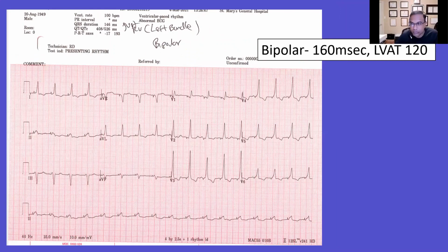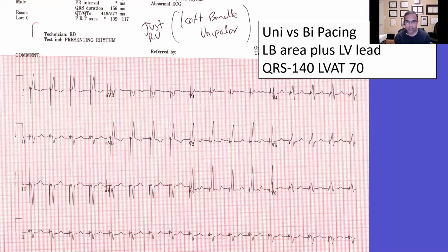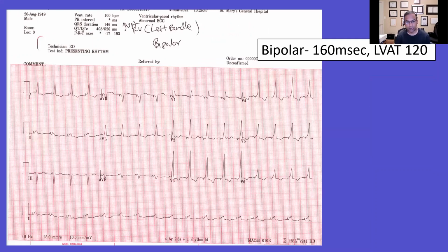Yeah, that's usually what happens. With unipolar, you get this beautiful classic selective left bundle type pattern. And then when you go to bipolar, suddenly you get this almost pre-excitation slur looking thing, and it's not quite as crisp, and there isn't as much latency. It's usually just because you're not completely selective, and your ring may be outside the left bundle region, or part of your ring may even be outside the septum. Only half the ring is capturing right at the corner of the septum. So I think that's probably what's going on.